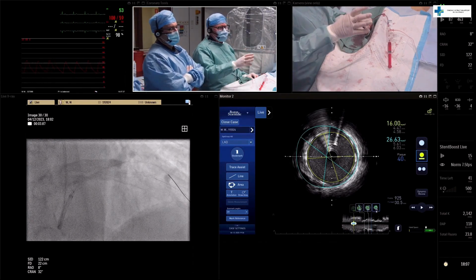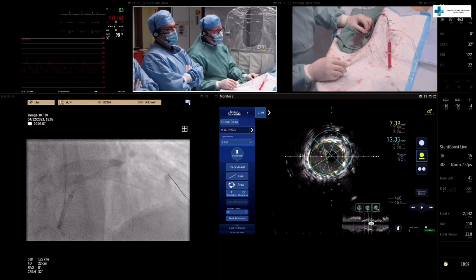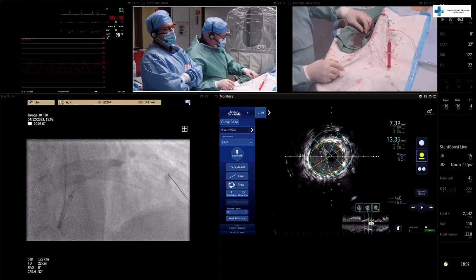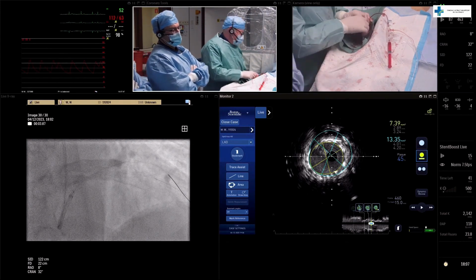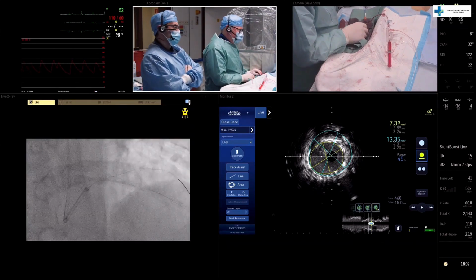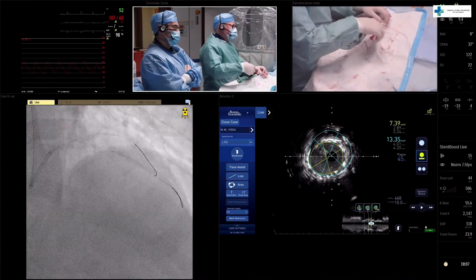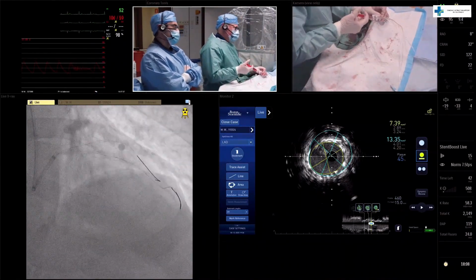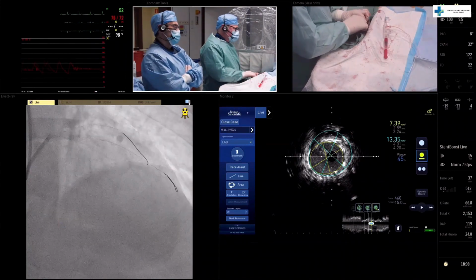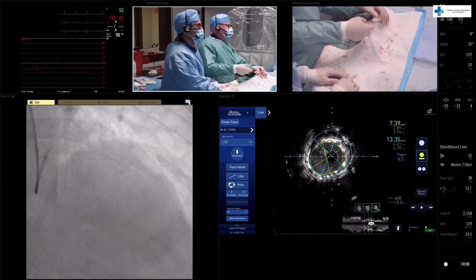So this looks okay. We also checked the LAD. And in LAD, we have 7.4 square millimeters. I believe also acceptable result. Previously, we performed the assessment of the circ, which looked good. Let me remind you that we did also drug-coated balloon post-dilatation. So now I will remove the wires and I will do final angio.